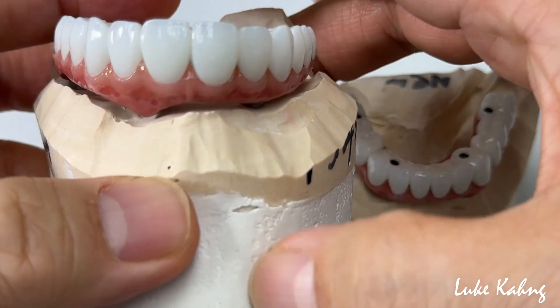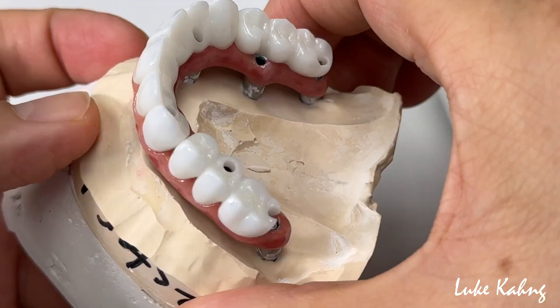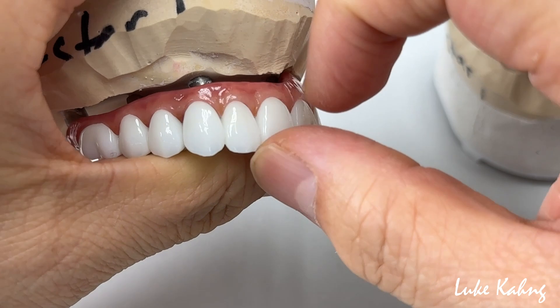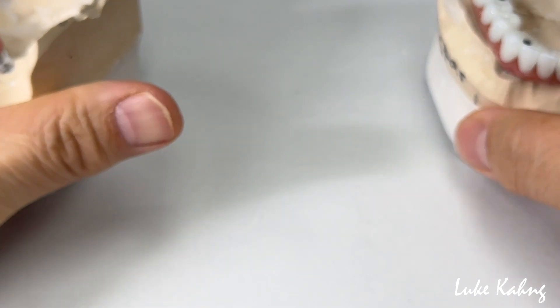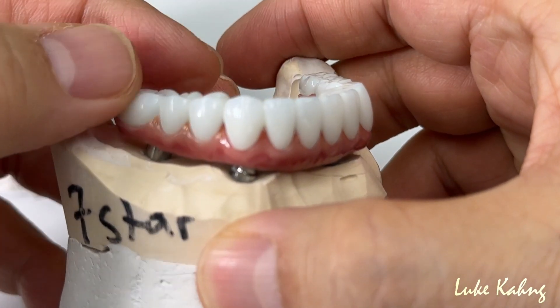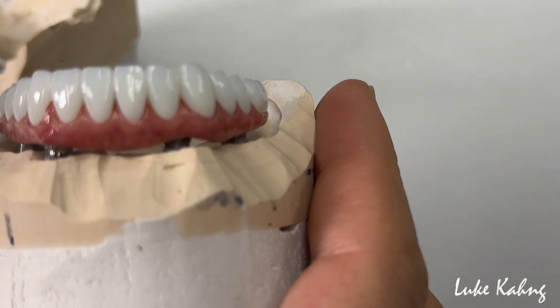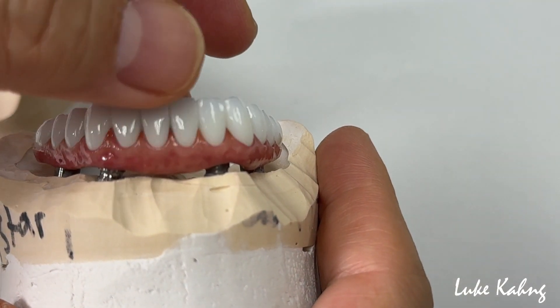This is the 7-star case — 6 pieces. Great matching. Remember, I mentioned it when I ground the tissue: it was really challenging in some areas we covered with the porcelain. It's not composite — now it's really good. The maxillary and lowers — same things — match great aesthetics and strength. The reason I made the two pieces: I always mention it, you get maximum strength after you bond it and it never breaks.